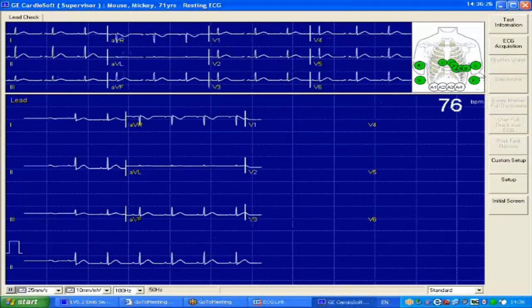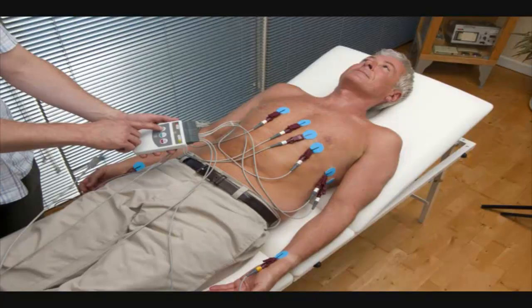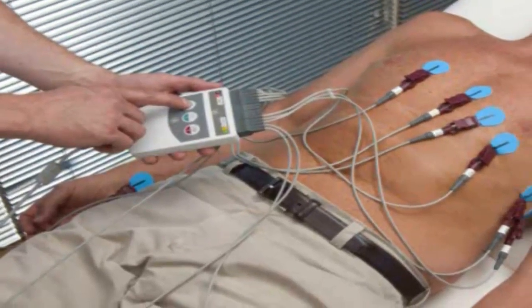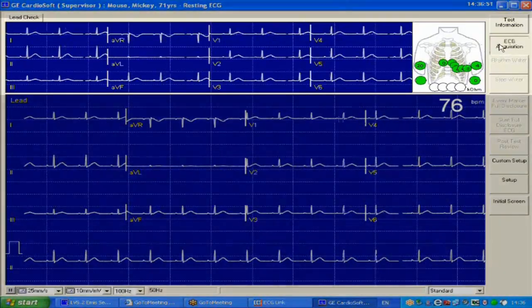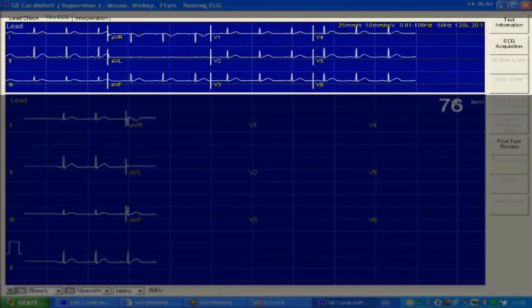If you have a nervous patient or wish to be next to your patient whilst taking the ECG, simply press the first button on the ECG cable hub as shown. Once the Acquisition button is pressed, the ECG is frozen and saved as shown at the top of the screen.